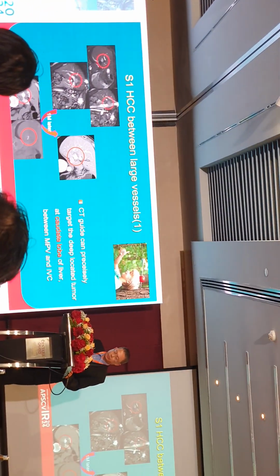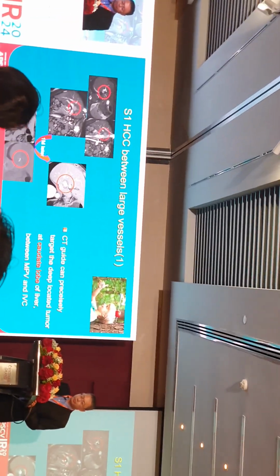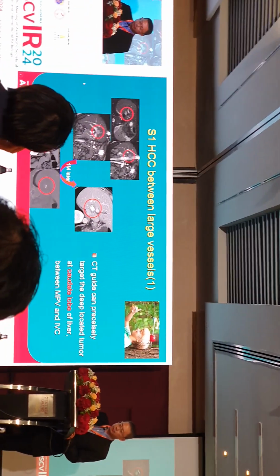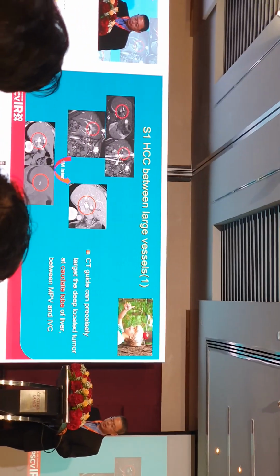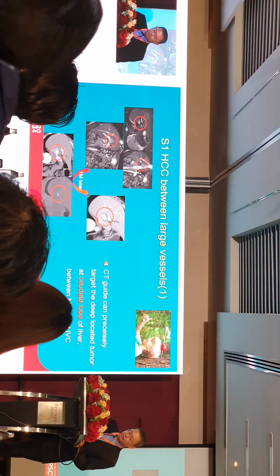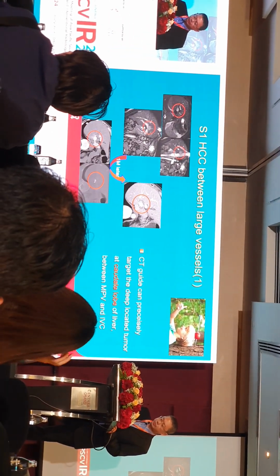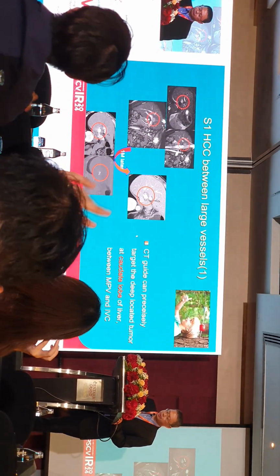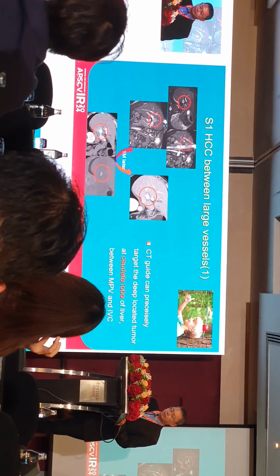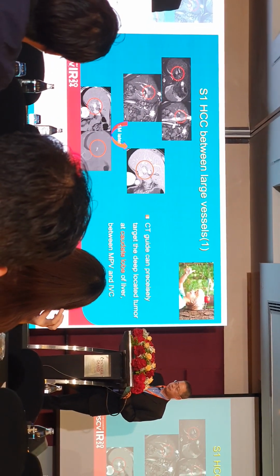For S1 HCC between large vessels, the tumor is between the portal vein and IVC, with indentation on the portal vein and IVC. After the lipiodol TAE, we can show dense lipiodol retention in the tumor, and I used only one electrode, with the first position near the IVC and another position very close to the portal vein. One month later, there was complete ablation of the tumor and no injury to the major vessels.